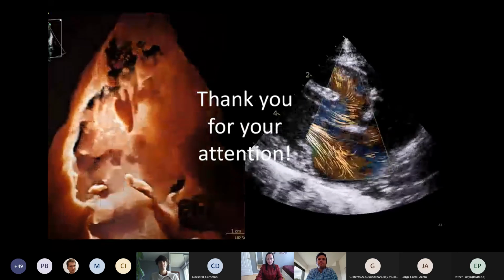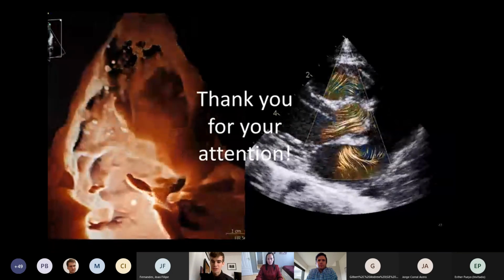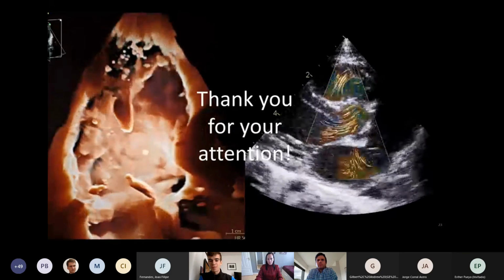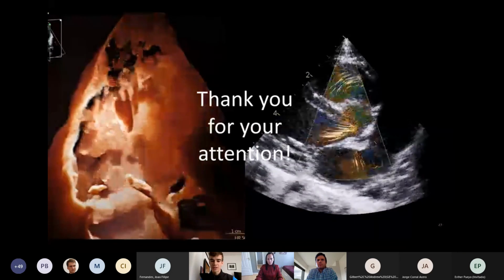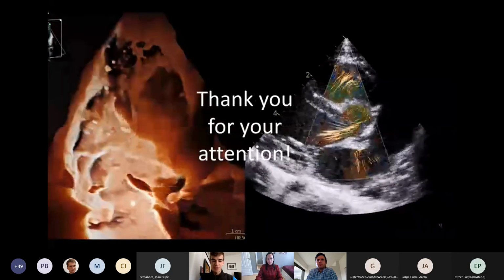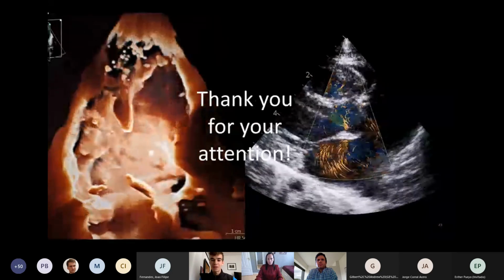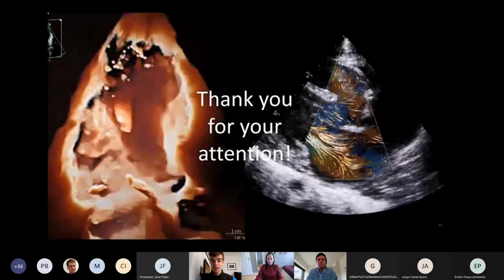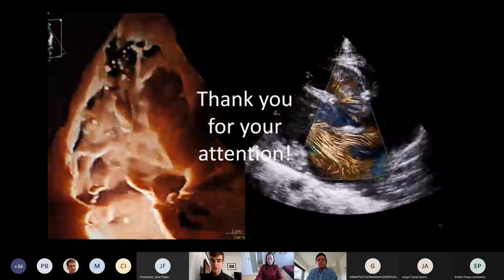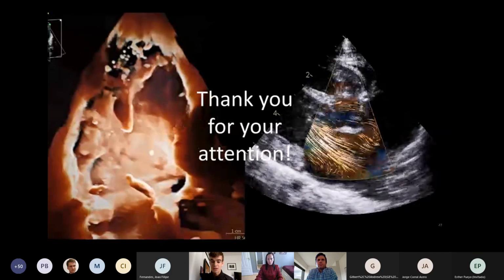Great. Cameron, hi. I had a question about the blood speckle imaging that you've got on the screen there. On your slide, you had the paper that I think is actually in pediatrics. My colleague and I were playing around at the end of last week with the pediatric probe and trying to do some speckle imaging on my heart, and it didn't really work that well using a pediatric probe in an adult, obviously. I was just wondering whether this blood speckle imaging is coming to adults, or if that's something that might be around in the future.